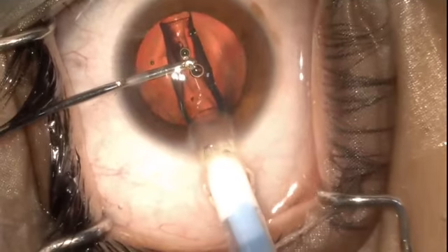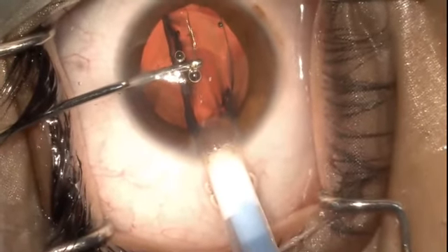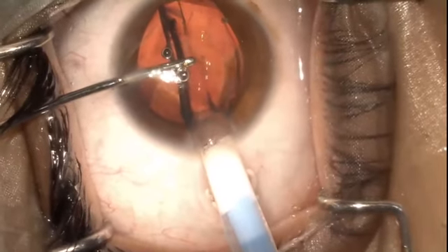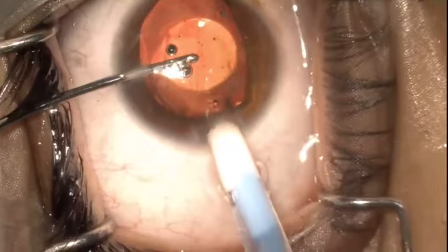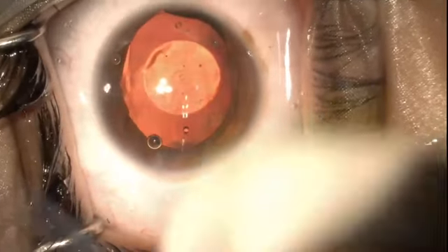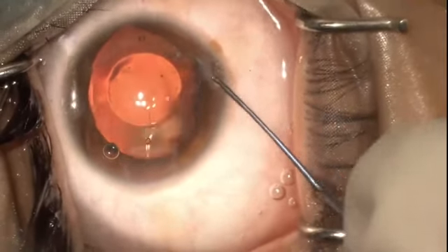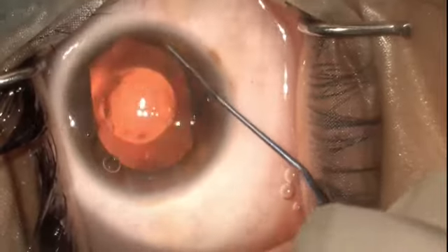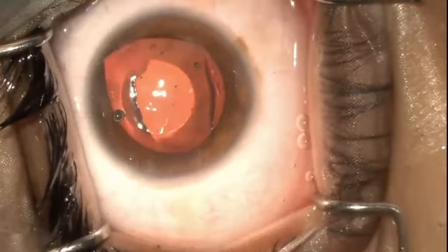As you can see, I have a 23 gauge cannula over the haptic and the ICL is opening properly inside the eye. Place some viscoelastic and with the help of this manipulator, put the haptic behind the iris.